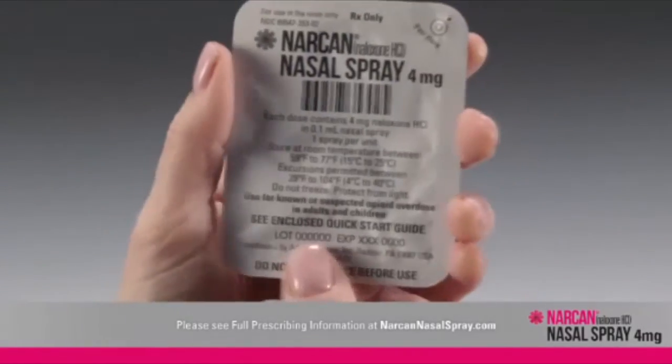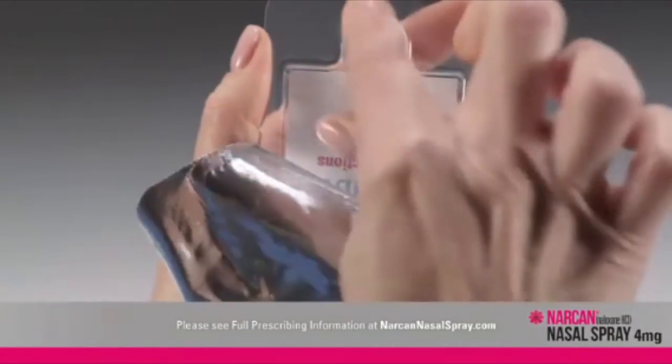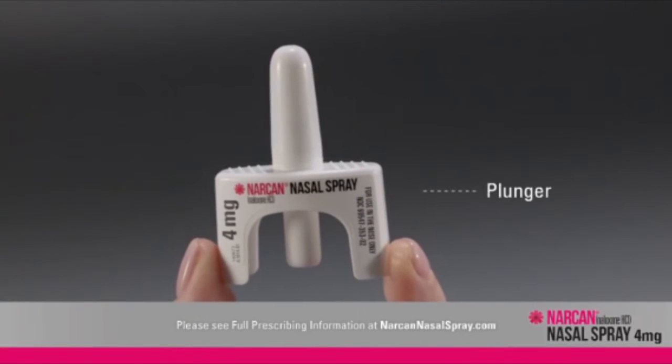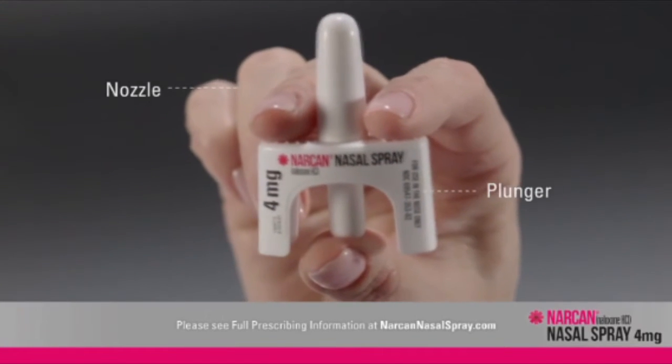Remove Narcan nasal spray from the box. Peel back the tab with the circle to open it. Remove and review the printed quick start guide inside the package. Hold the Narcan nasal spray with your thumb on the bottom of the plunger and your first and middle fingers on either side of the nozzle.